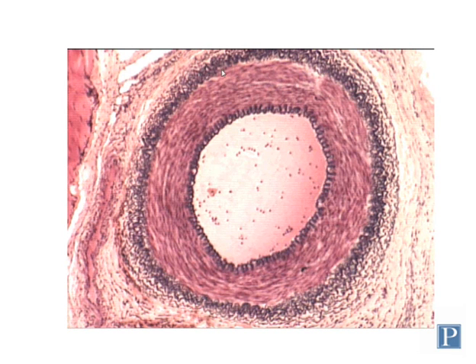Endothelium is always a single layer thick because it's always composed of a simple squamous epithelium, and so the superficial most layer of the Tunica Intima is adjacent to the lumen. Now at this particular magnification, the endothelium is really hard to distinguish from the other layers of the Tunica Intima. Underneath the endothelium you have some subendothelial connective tissue, and just deep to that you have what is known as the internal elastic lamina, which is a sheet of elastic connective tissue that's found in the Tunica Intima.